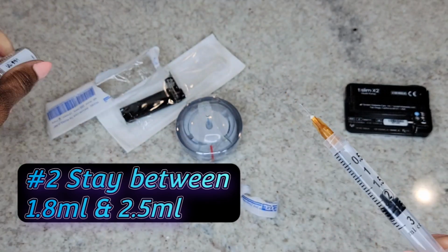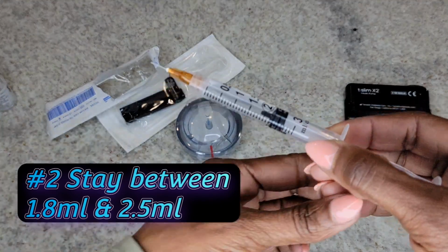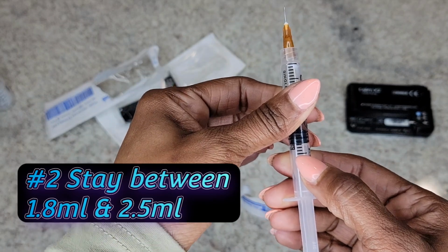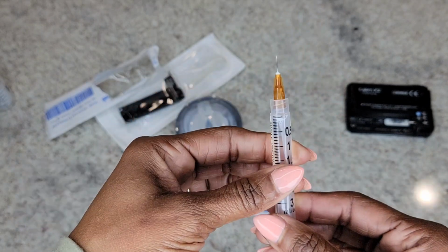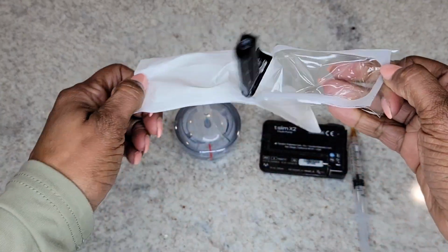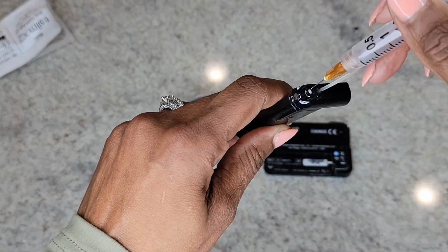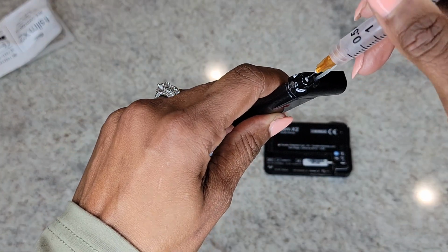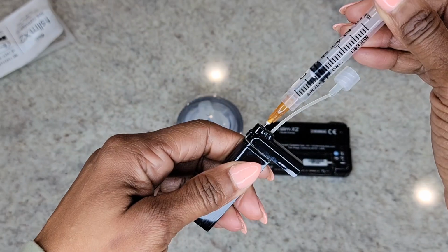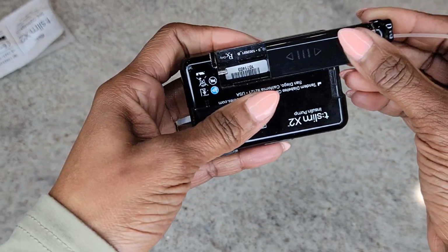Now, when I first got on this pump, I did not stop it and I would go all the way to the 3. And that caused a lot of issues with air bubbles and insulin delivery, and my sugars would always end up high. So don't do that. Nope. Okay, then the next step is to get the insulin inside of the new reservoir casing. So stick that right through there. And you just push the insulin in. Just like that. Then we're gonna attach the reservoir to the pump.